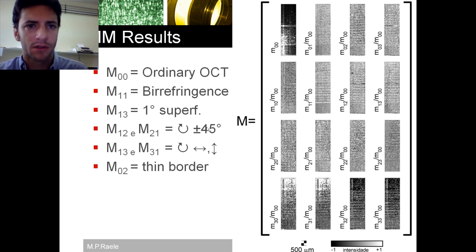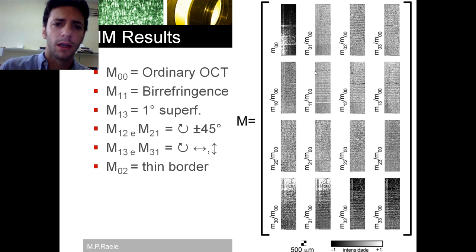And we have some features that I will talk about like this one. It is very clear in this element, the birefringence. You can see like a wave going through inside my sample. This is due to the birefringence.